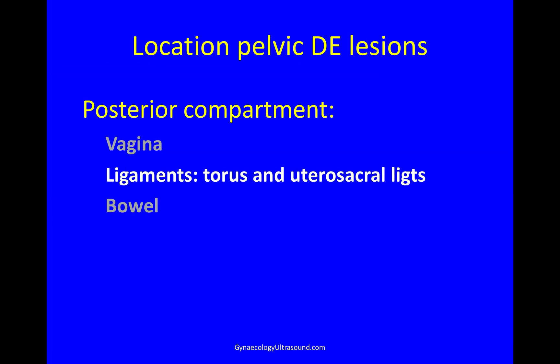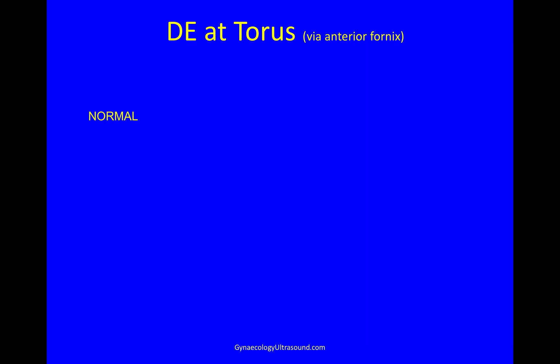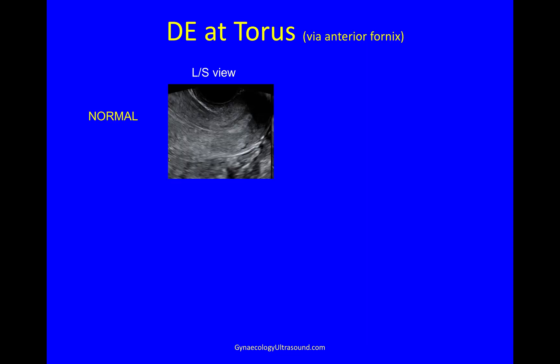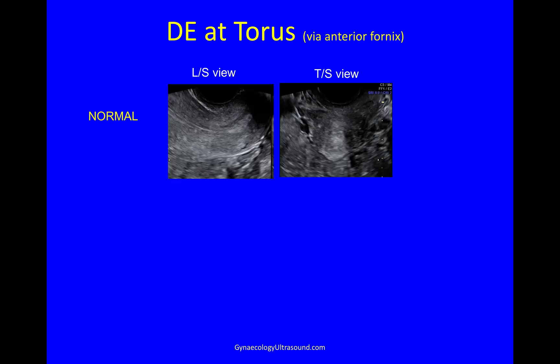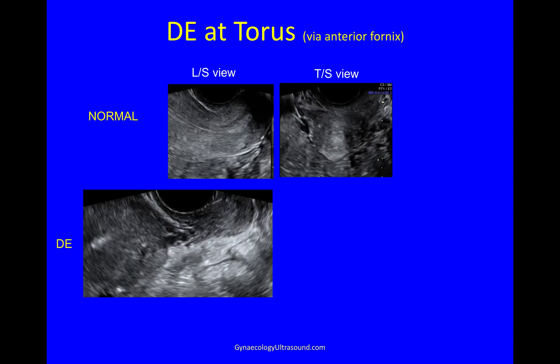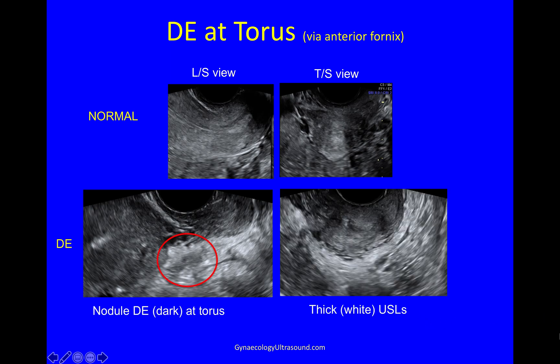Next, I look at the ligaments — the torus and utero-sacral ligaments. We saw already what normal ligaments look like. And this is thick, fibrotic utero-sacral ligaments behind the cervix, with a nodule of deep endometriosis in it. And on the transverse plane, you can clearly see thick, fibrotic utero-sacral ligaments.